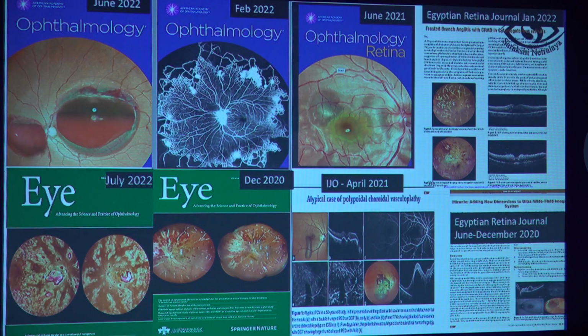And most importantly, how it changed my practice is that when anyone asks me what is the ROI, this is the return on investment in all this equipment. Besides the fun, besides the satisfaction of having done fully for the particular patient who presents to you. Because in a standard fundus photography, you see only 70 to 80 degrees, while ora to ora is 220 degrees, which is now possible to visualize. So you do not sleep with a feeling that I'm missing something, that probably I might have missed something.